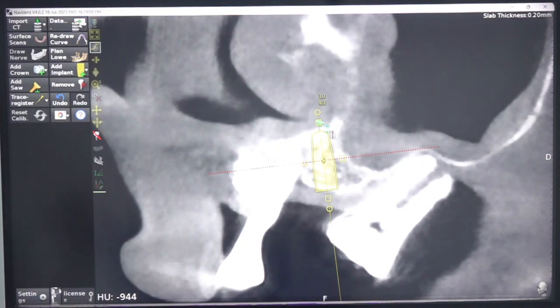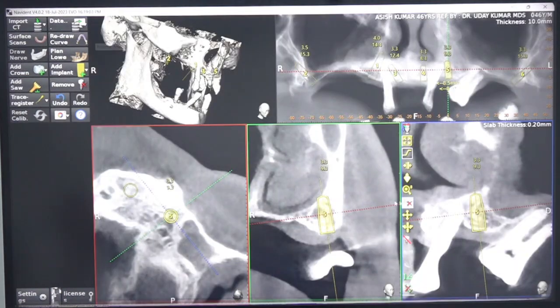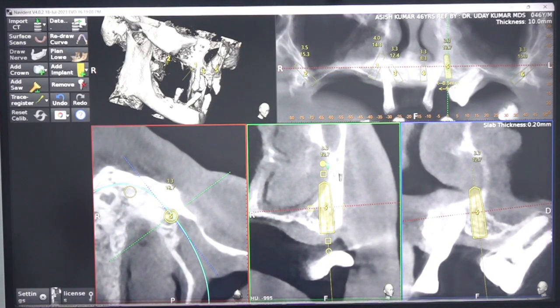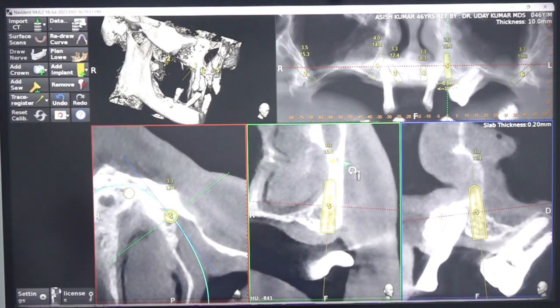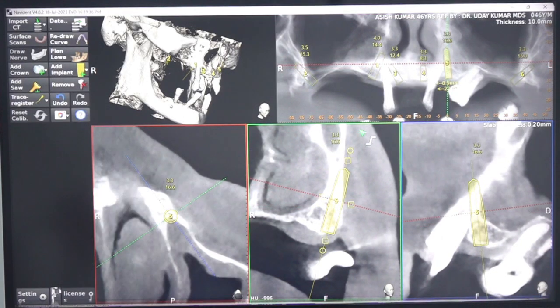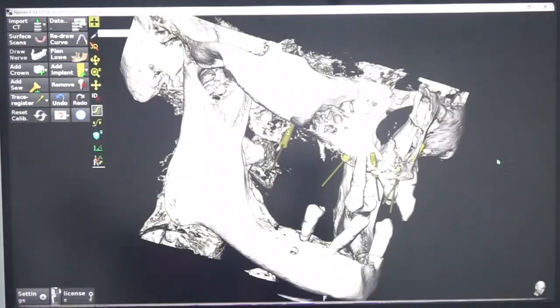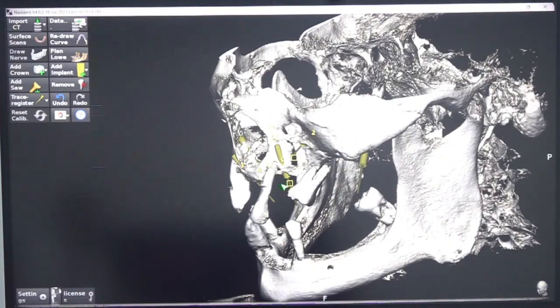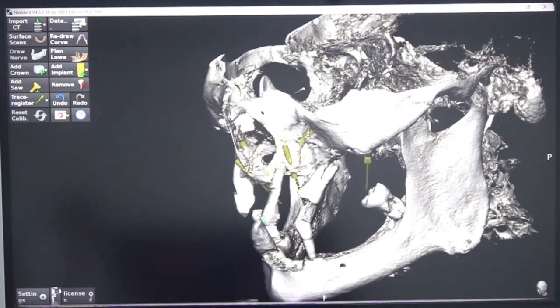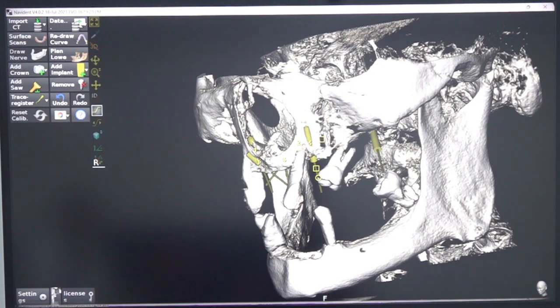Do the palatal approach, come closer to the buccal area. Okay. Maybe like this. You can place an 11 or 12 implant. We will see the target area. So for any distal tilted implant, only 2 things we need to know. What is the starting point? The starting point is just distal to the canine, and what is the ending point? It is similar to the right side, the buttress area, and what approach, palatal approach. 3 things we need to know for the distal tilted implant.